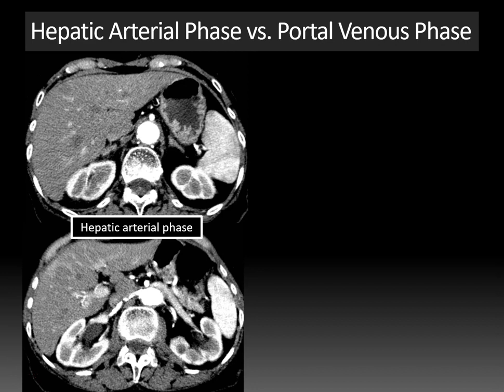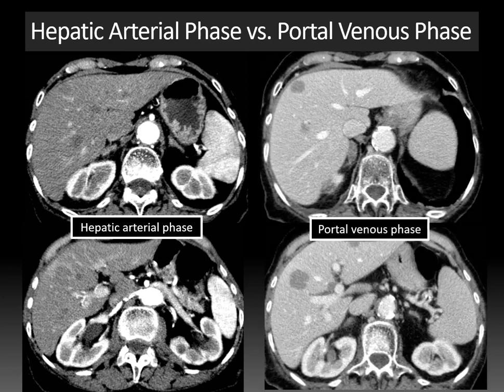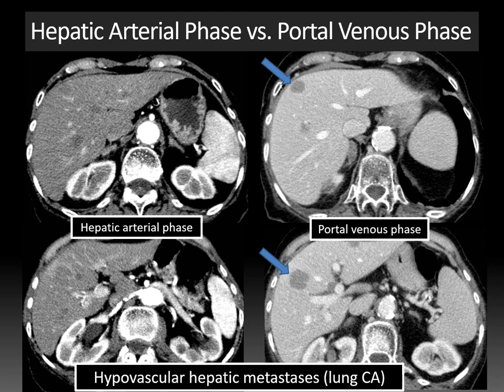Here's an example highlighting the difference between hepatic arterial and portal venous phase in detecting hepatic lesions. On the hepatic arterial phase images, the hepatic artery and portal vein are enhancing with no hepatic vein enhancement. But when we look at the portal venous phase, the hepatic veins are now enhancing along with the parenchyma — and look at all these hypovascular hepatic masses that were very difficult to see on the arterial phase, even in retrospect. This was a patient with lung cancer and hypovascular hepatic metastases — the portal venous phase is ideal for their detection.